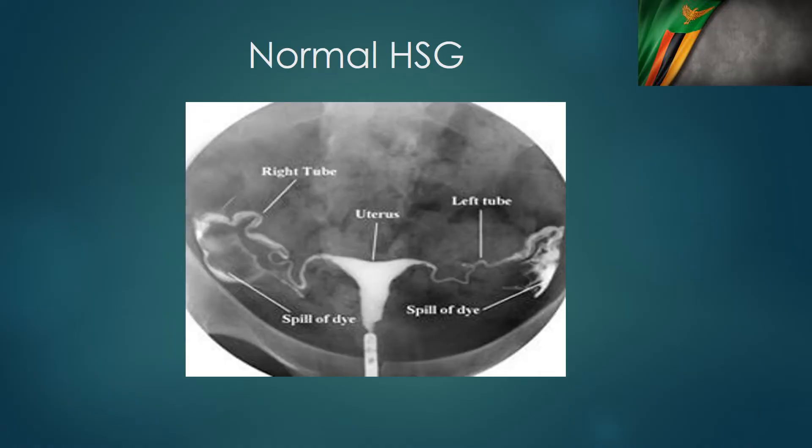This is a normal HSG where we can see the uterus is clearly visible, the tubes are thin and clearly visible, and we can see the spill of the dye on both sides. An important reminder: when we see a spill, we need to remember that what we are measuring is tubal patency and not tubal function per se.